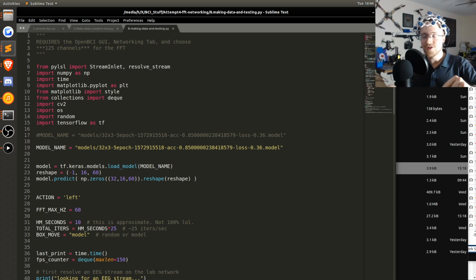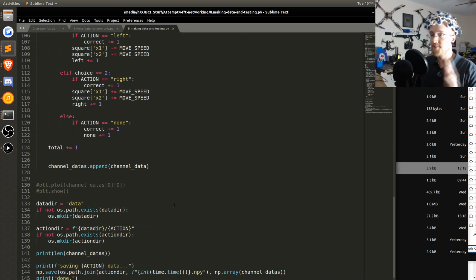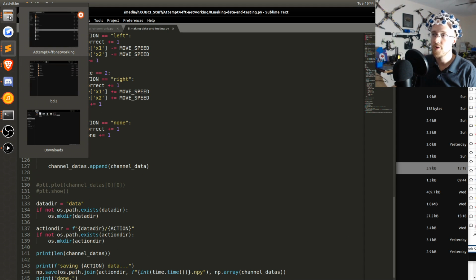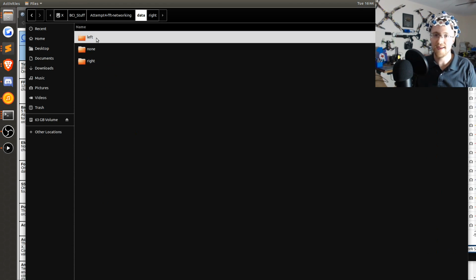So I know there's something there, but as you could see in the beginning, there's a lot of wiggling going on. And there's plenty of times I'm thinking left as hard as possible, and that box goes right. So definitely lots of things to work through, more data to create, possibly changing up the model. And even if I go with a recurrent net, I still have the data that would be required for that. Really, right now I'm just collecting FFT data on thoughts of actions. From there I can go many ways, unless I end up deciding FFT is not informative enough. Garbage in, garbage out. But I think I've got an edge already with a pretty basic one-dimensional convnet.